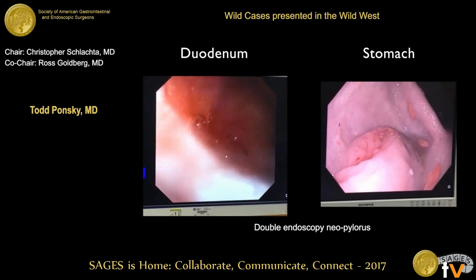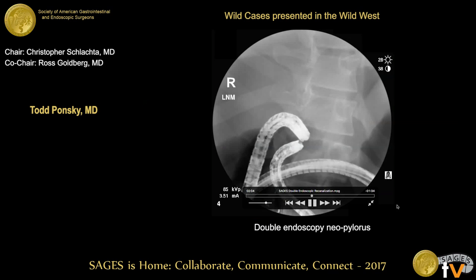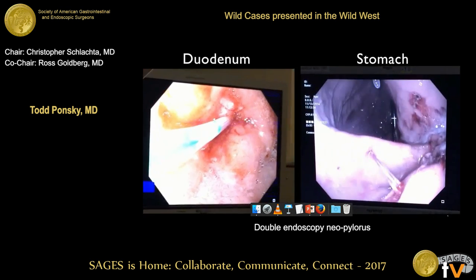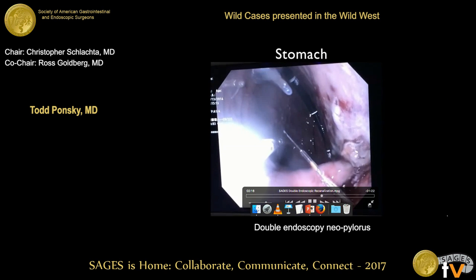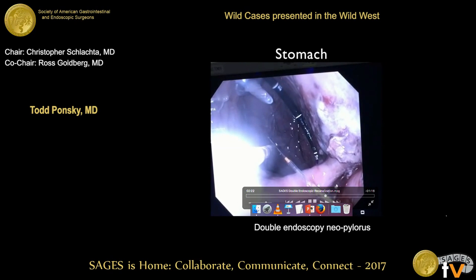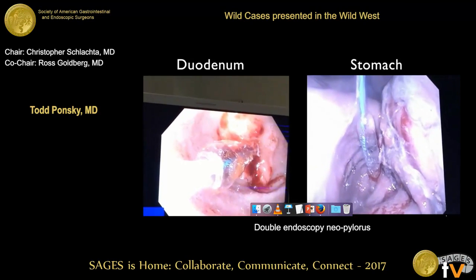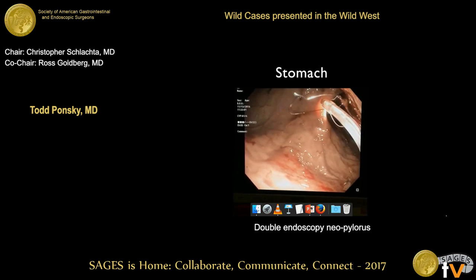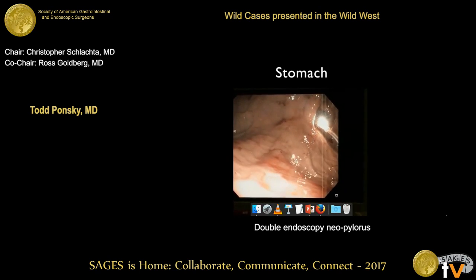Cannulization was first attempted with a blunt catheter unsuccessfully. Fluoroscopy was used to align the endoscopes. A 1.8 millimeter needle knife was then pushed through the membrane from distal to proximal with clear visualization from the contralateral side. A guide wire was passed through the needle and the needle was removed. A balloon dilation catheter was then passed over the wire and the neopylorus was sequentially dilated to a maximum of 10 millimeters. The patient's original G-tube and J-tube were removed and replaced with a gastrojejunostomy tube acting as a stent to ensure patency of the neopylorus.